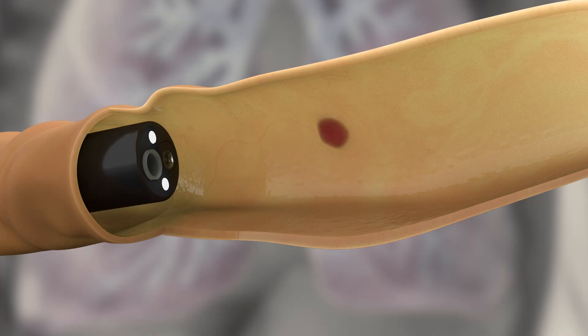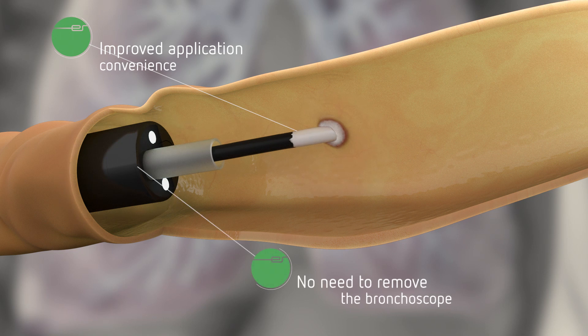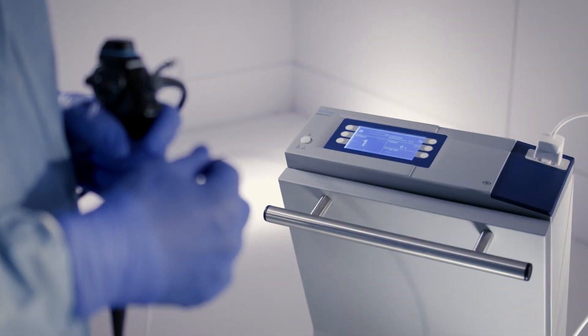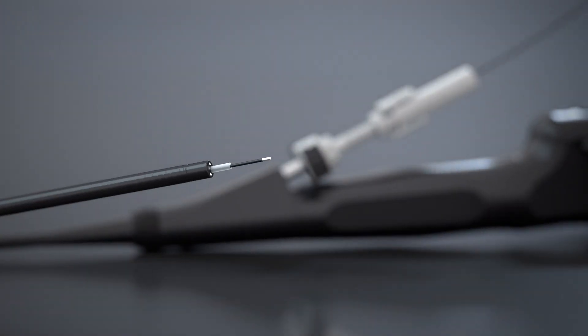With this combination, biopsies can now be extracted quickly and easily through the working channel of a bronchoscope. The bronchoscope does not have to be removed from the target area for the cryo extraction. With this unique extraction technique, the physician always maintains visual control and is able to react quicker to complications.